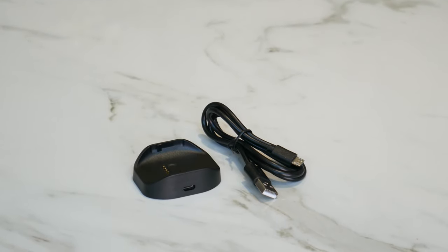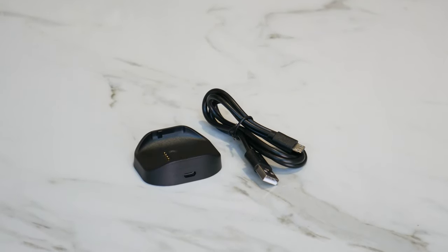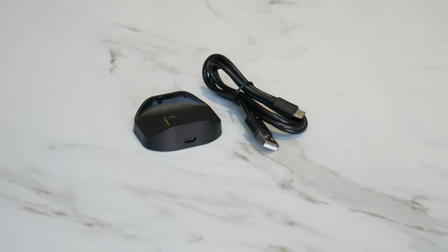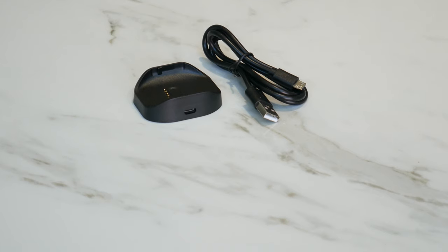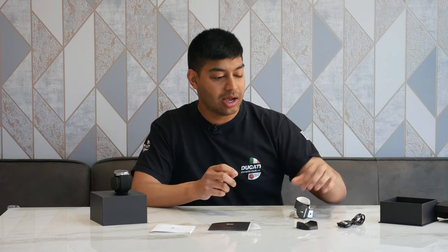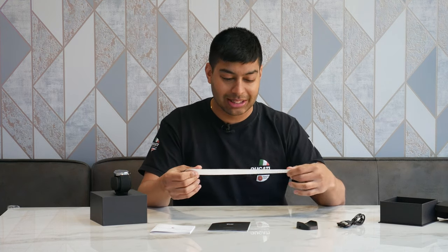The charging dock isn't a magnetic charging dock like you get on some other smartwatches — it's actually a clip-in one. We'll have a look at that later. You've also got a micro USB cable for the charging dock — not a Type-C, just a normal micro B cable, which is a bit strange.